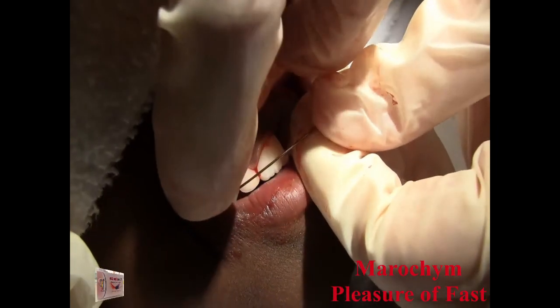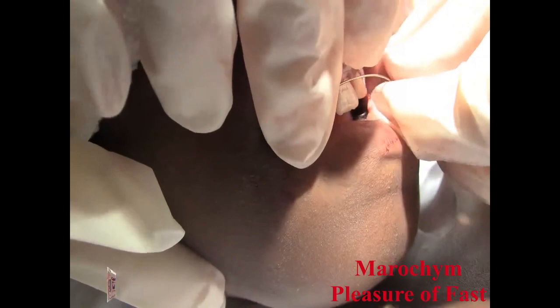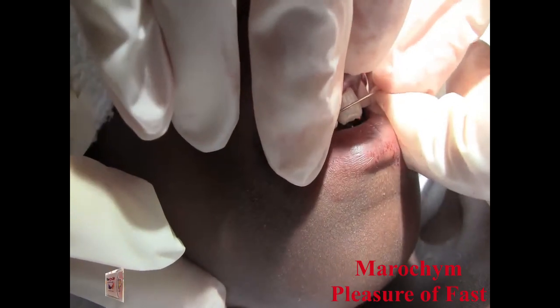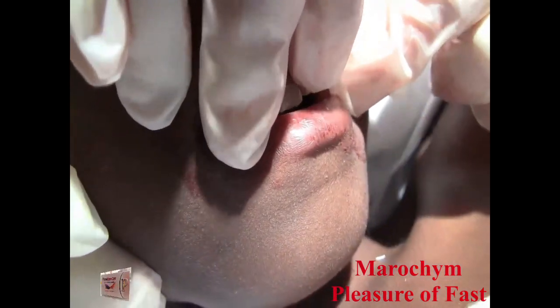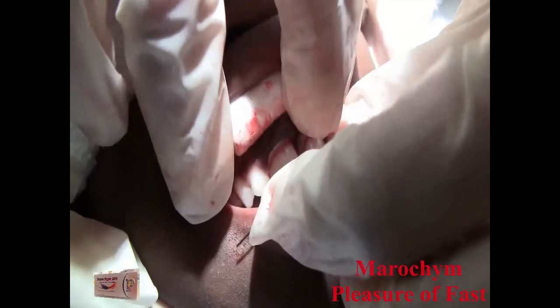It's a little bit of wire, sweetie, if it feels funny, okay? Yeah, we'll trim it a little more. Let me just get out of this. And take a little off that side. And a little off that side.